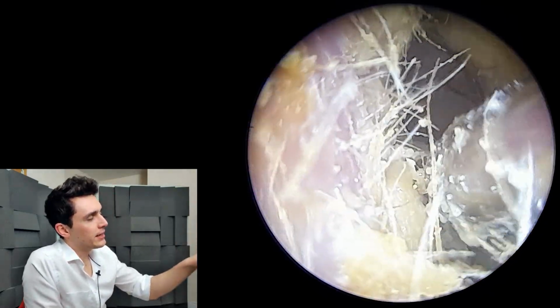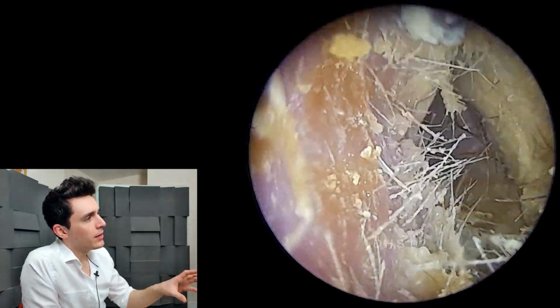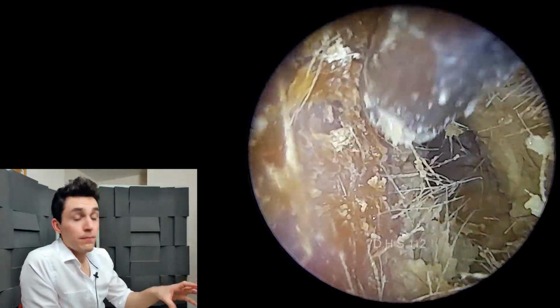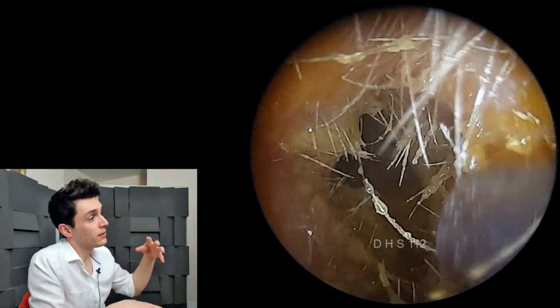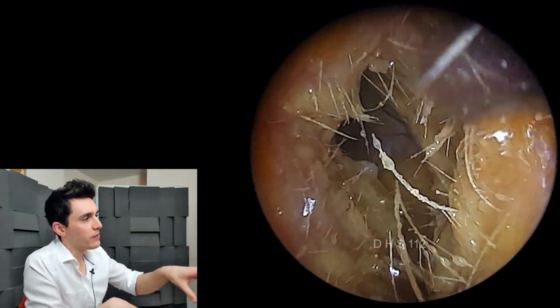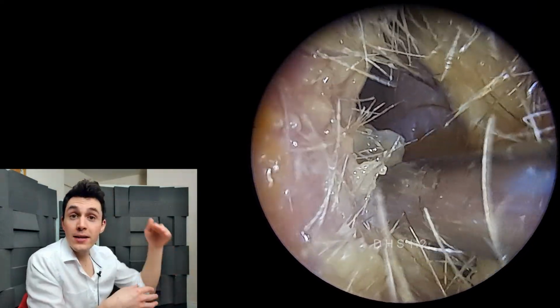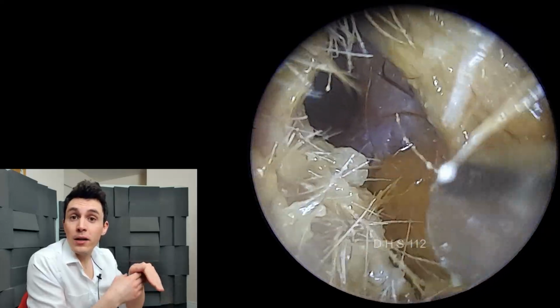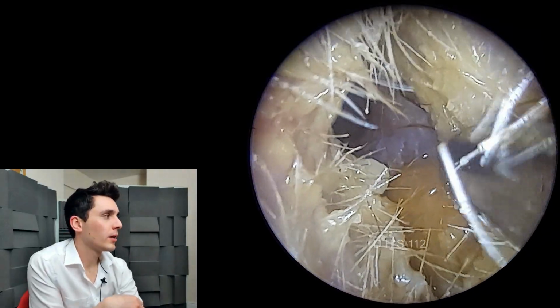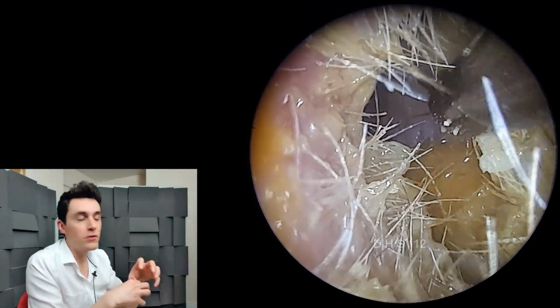So tons of dead skin here, and the reason that this has happened is because when bacteria enter your living tissue, so when a foreign invader, this is just sodium bicarb that I've applied, that's why everything looks wet at the moment. When bacteria enter your living tissue, they will eventually be intercepted by white blood cells called sentinel cells. And sentinel cells are just white blood cells that are stationed around your body within tissue.